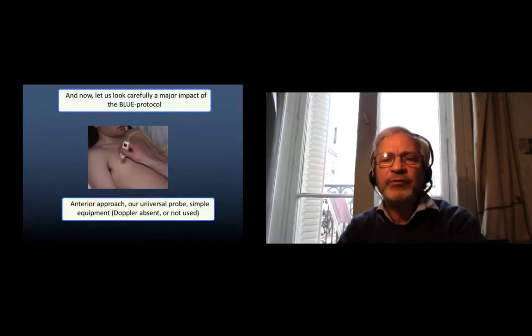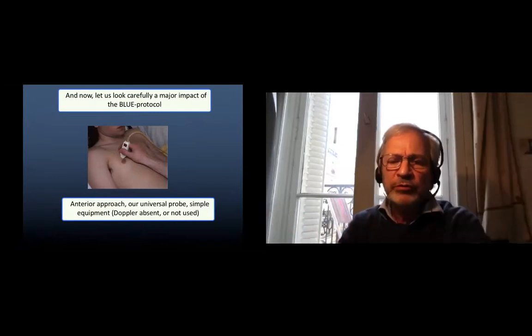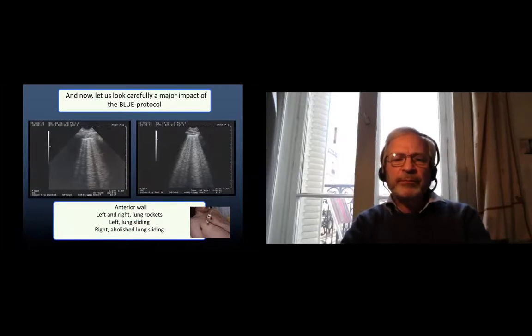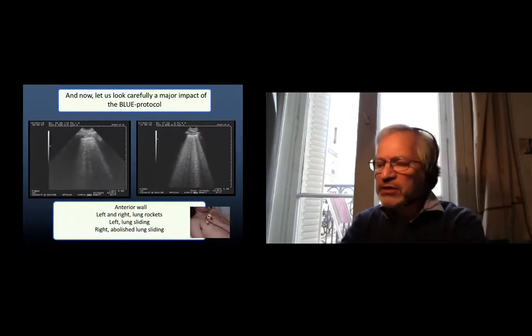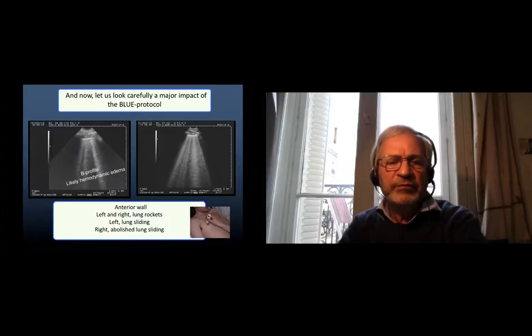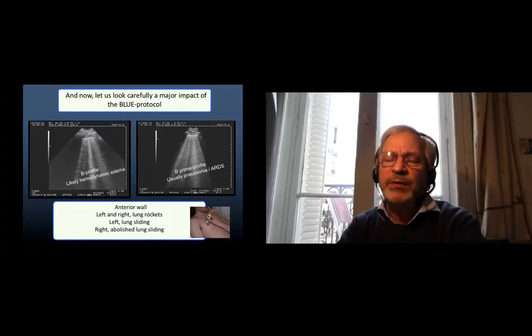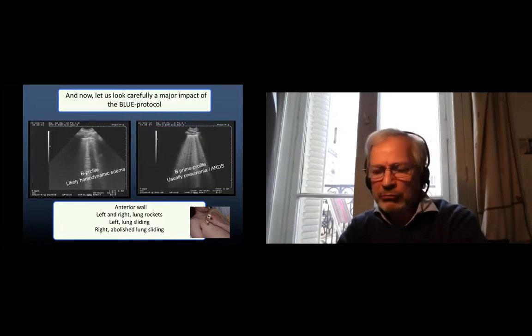Now let us see carefully. We are at the anterior wall left and right. We see lung rockets. To the left there is a lung sliding. To the right there is no lung sliding, it is abolished. Very basically we can say to the left this is the B profile, of likely a hemodynamic edema, and to the right this is what we call the B-prime profile, which is almost always pneumonia and/or ARDS, which is the same to simplify.